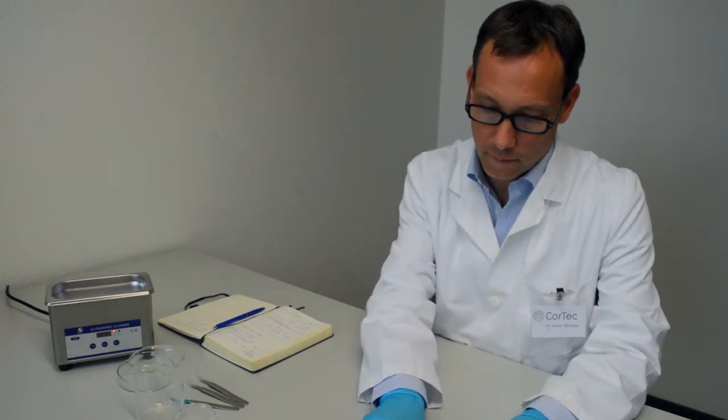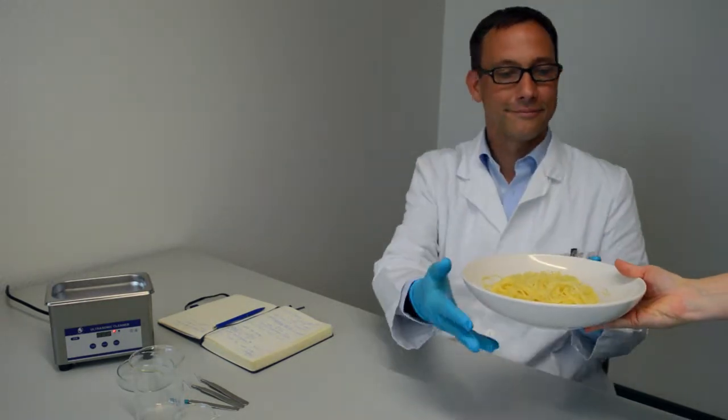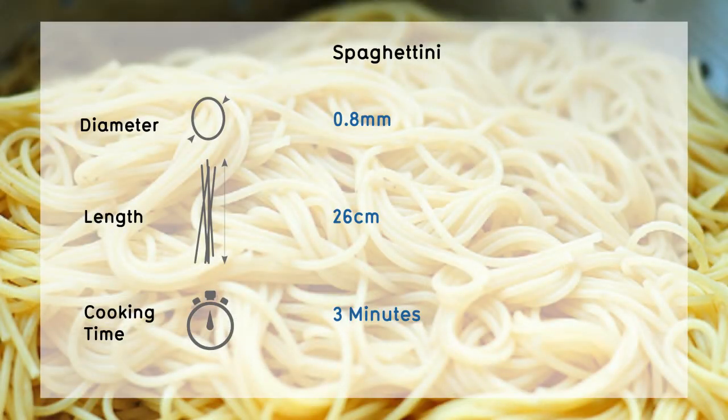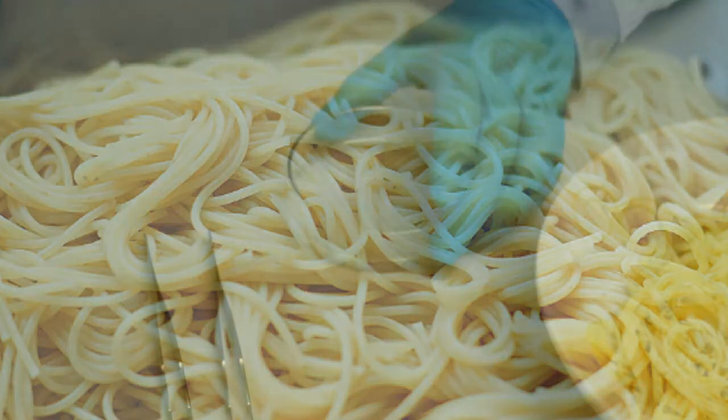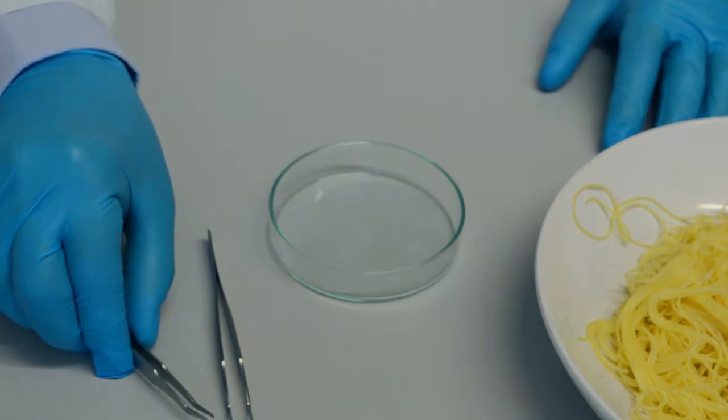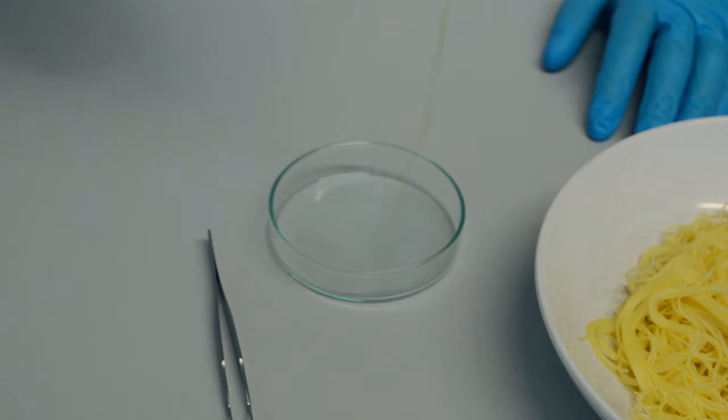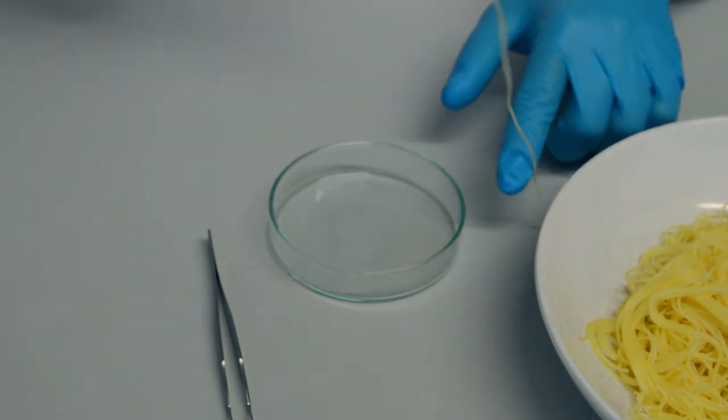Now let's see where we are putting it. Nerves are quite delicate to handle. We found the ideal substitute: spaghettini al dente. With a diameter of about 0.8 millimeters, our fitting model represents a medium-sized nerve. Like a nerve, it is soft, flexible, and easy to damage. Make sure that you have access to the implantation site, so freed from surrounding tissue. Obviously with our fitting model we do not have any problems here.